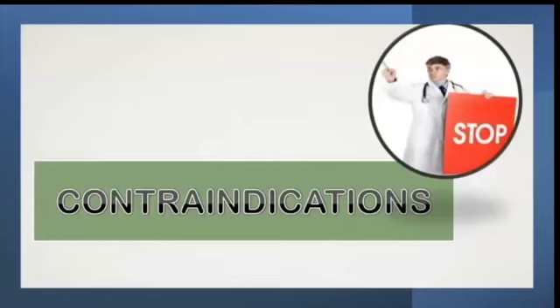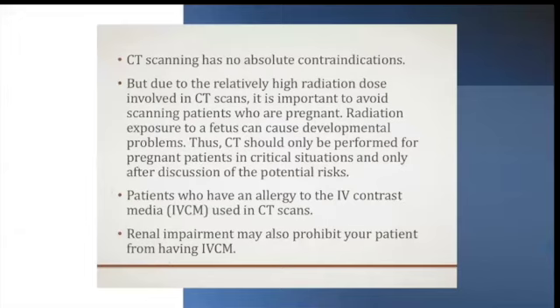So now, since we covered the main indications for a CT, we should also cover the main contraindications for a head CT. As some of you might know from the previous lectures, CTs use X-rays. And this simple knowledge of the fact that CTs use X-rays should guide you to the only concern with CTs, which is the fact that CTs use a certain amount of radiation. So we usually tend to avoid scanning pregnant patients because we don't want to expose their fetuses to any sort of radiation.